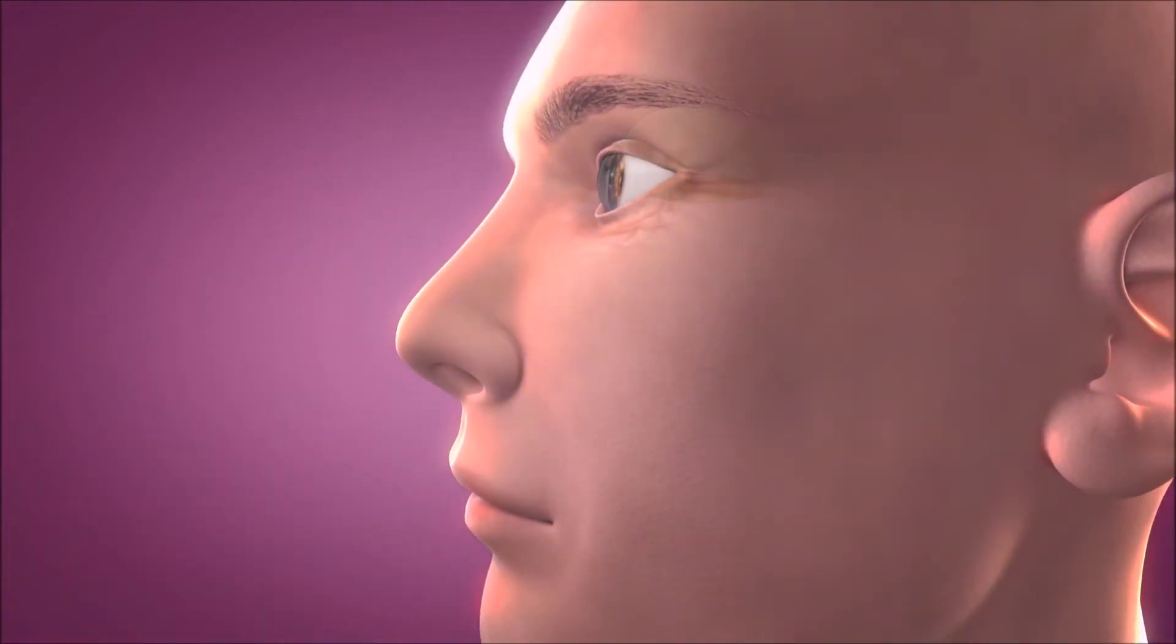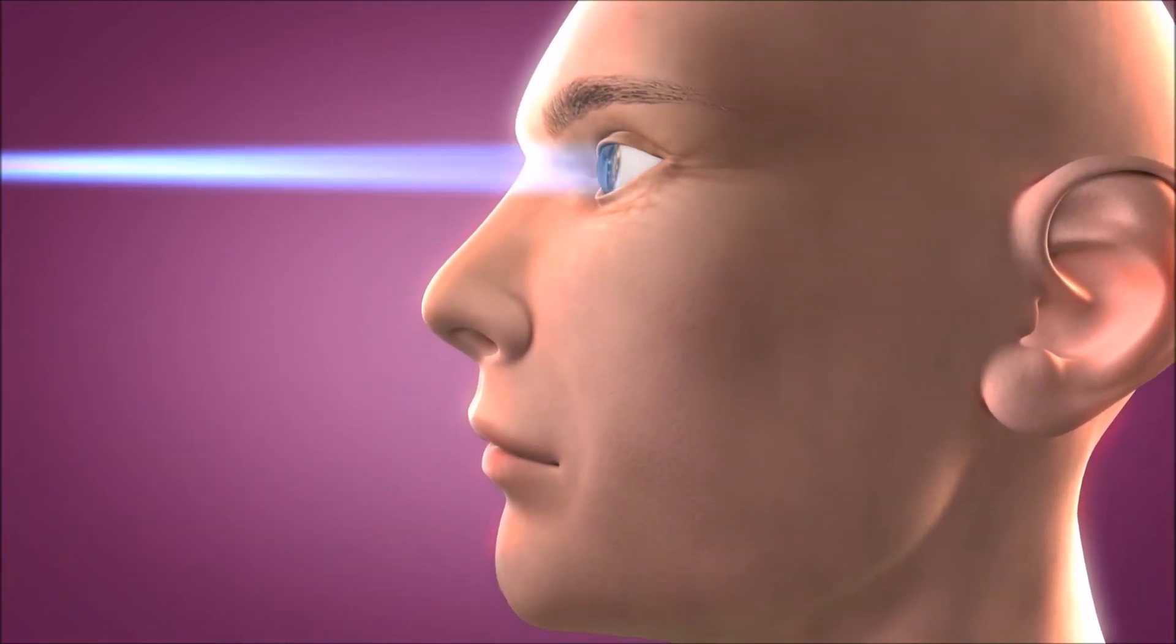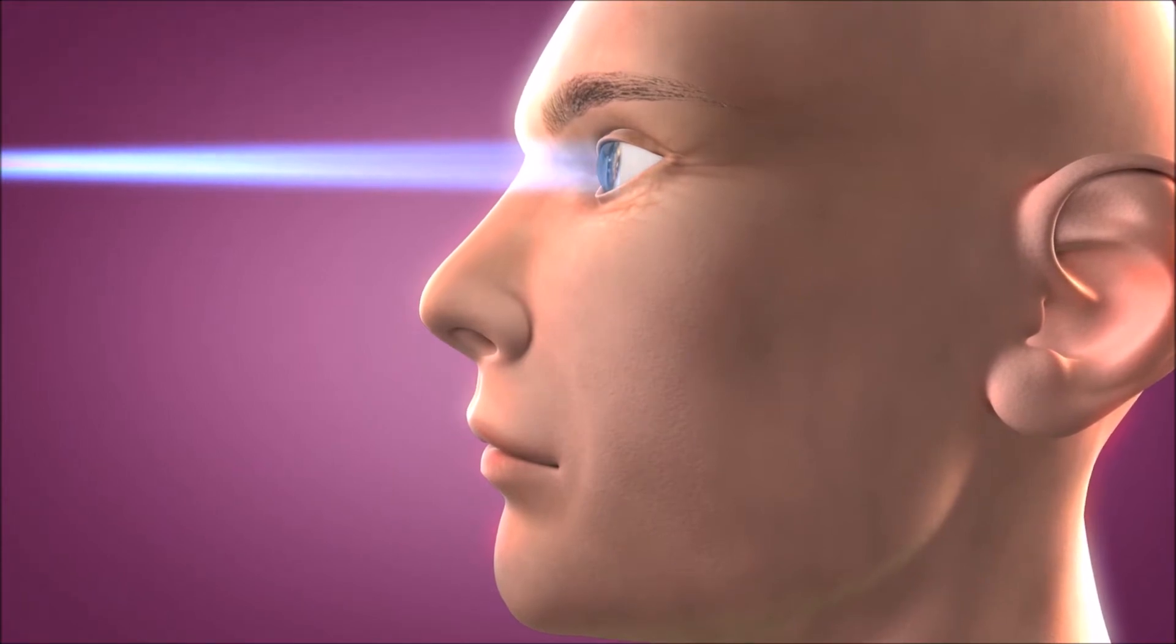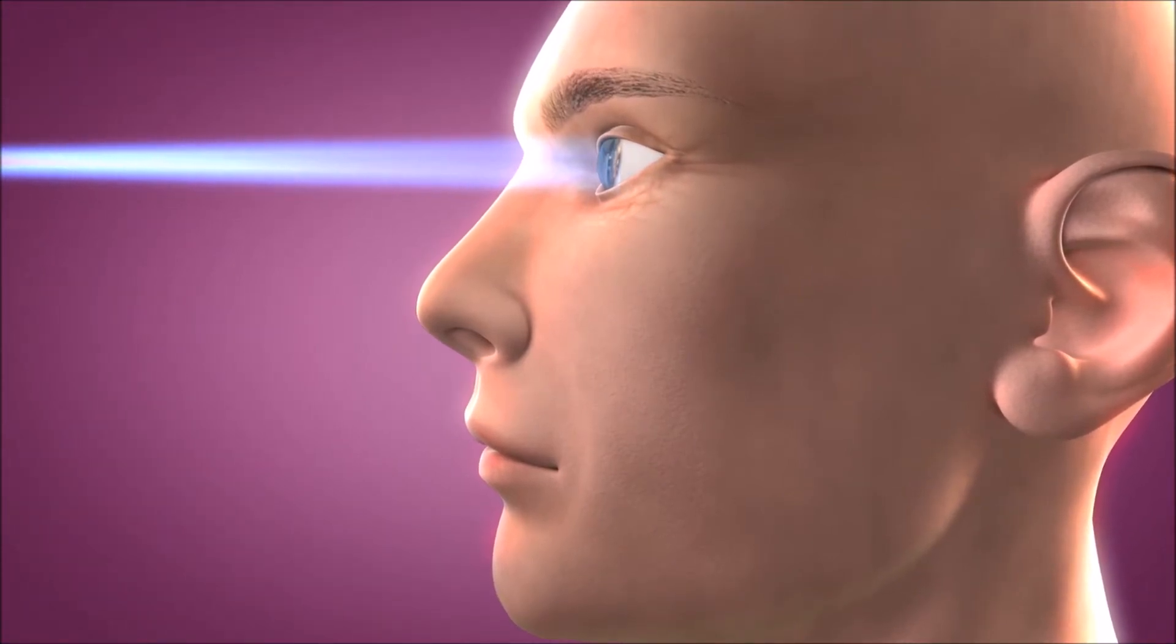RxSight's Light Adjustable Lens, or RxLAL, addresses the challenge of predictability by providing cataract surgeons with the ability to non-invasively modify the refractive power of the lens after the lens has been implanted and the eye has healed.